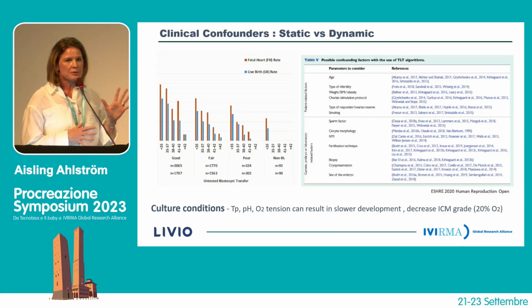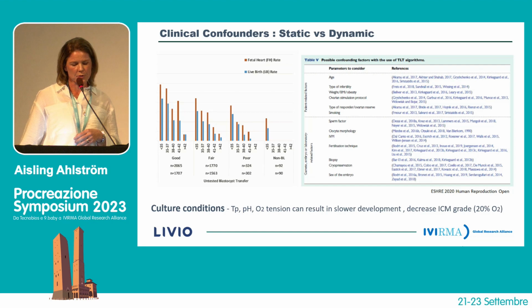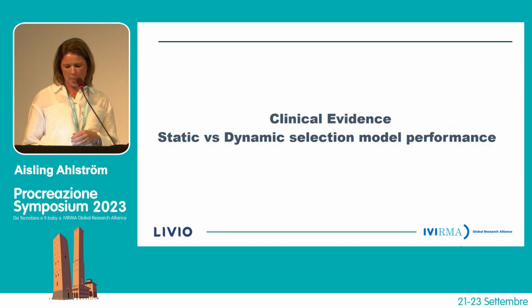And as I mentioned, there are a lot of clinical confounders that can impact both the Gardner score and these other timing variables. I think Amy Barry's group has really demonstrated this very complex relationship, in how the way we culture embryos and the patient and treatment characteristics can impact morphokinetic variables, and how they can be used for prediction or for selection of blastocysts.